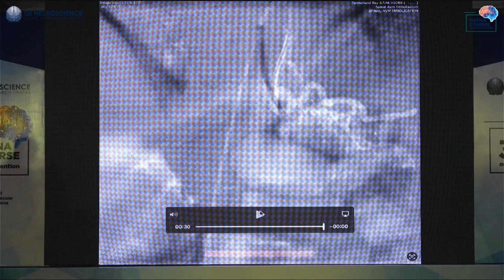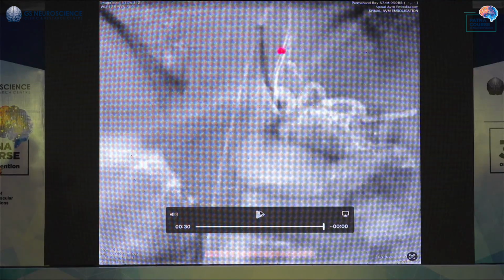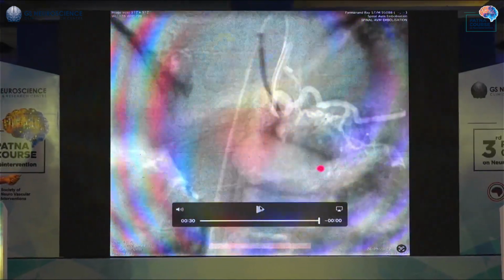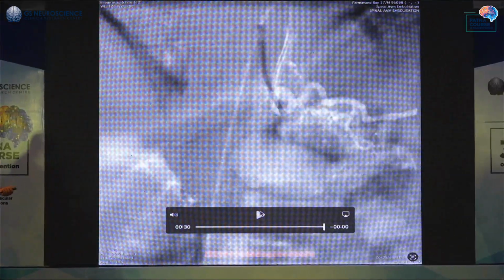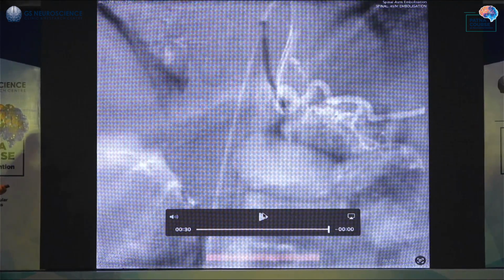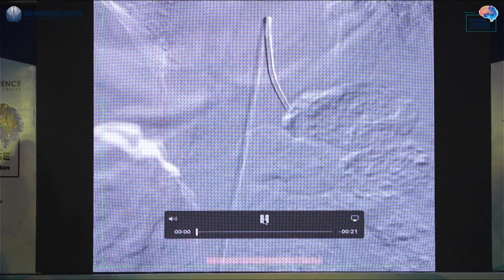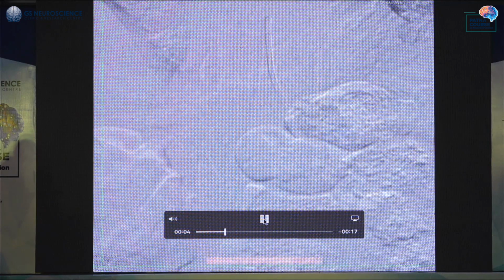So point number 1, you have to have a deep position in the intercostal artery, usually with a 4 French diagnostic catheter. The catheter initially for injection was in this configuration. Now you can see the catheter is in this configuration. With that, we are inside the intercostal artery. Use a SIM2, don't use a SIM1. Use a SIM2 with a larger curve so that you get extra backup from the opposite wall of the aorta. It compresses the catheter into the vessel. And then, once you have reached the position that you wanted to reach, the rest of it is pretty straightforward, pretty simple.